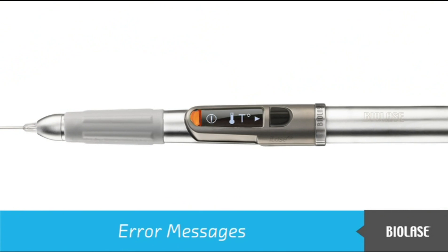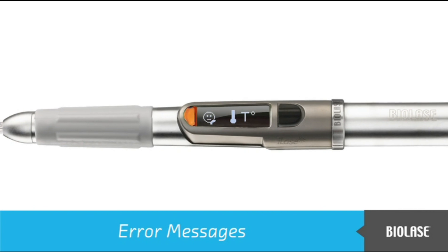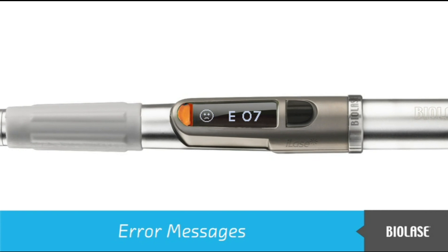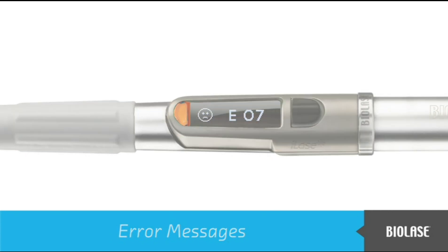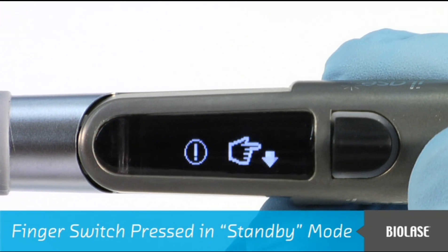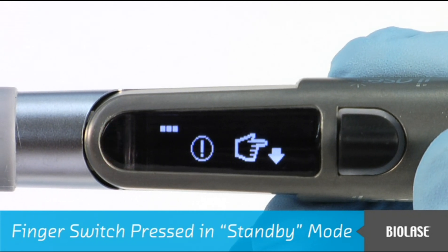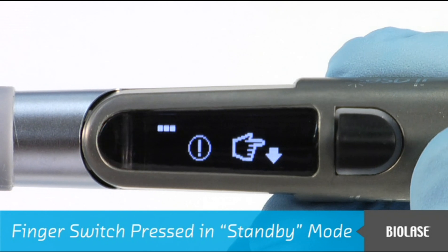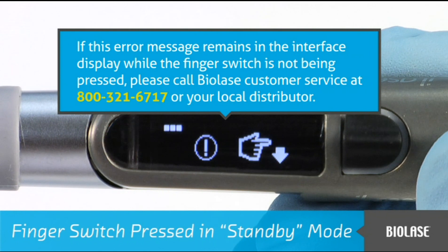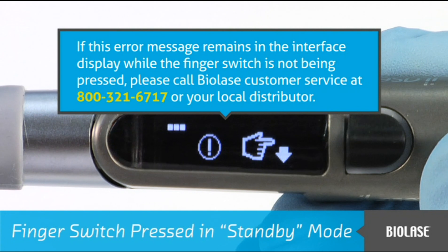From time to time, the iLaze interface display may show an error message. Presented here are some suggested actions if an error message appears. For further details, please refer to your iLaze user manual. If the finger switch is pressed while the system is in standby mode, you will see these symbols in the interface display. Releasing the finger switch will return the iLaze back to normal operation. If this error message remains while the finger switch is not being pressed, please call BioLaze customer service or your local distributor.